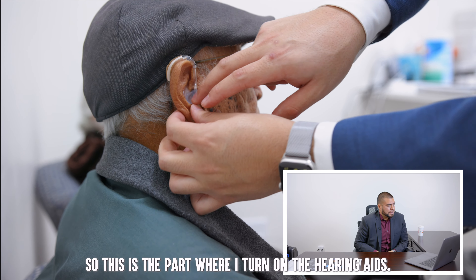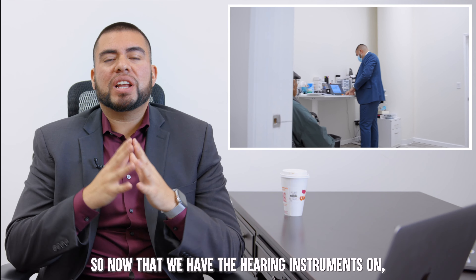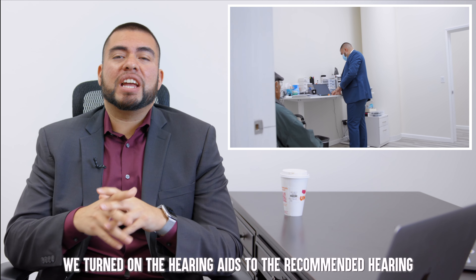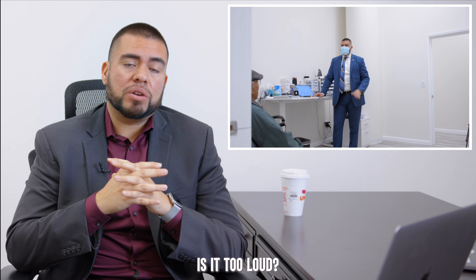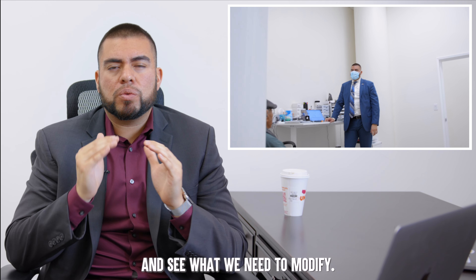Now we're at the part where I turn on the hearing aids. Now that we have the hearing instruments on, we turned on the hearing aids to the recommended hearing level for this patient's needs. We're going to go ahead and ask them: is it too loud? Is it too soft? Is it comfortable? And see what we need to modify.